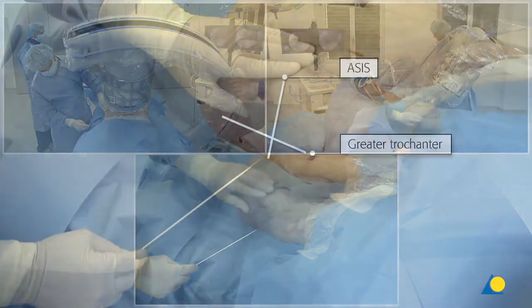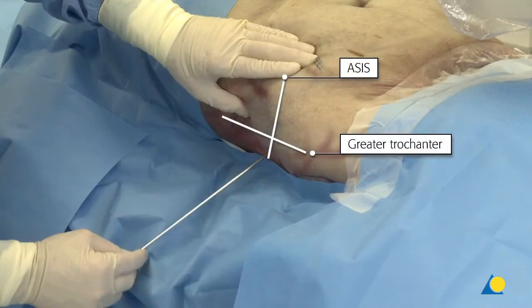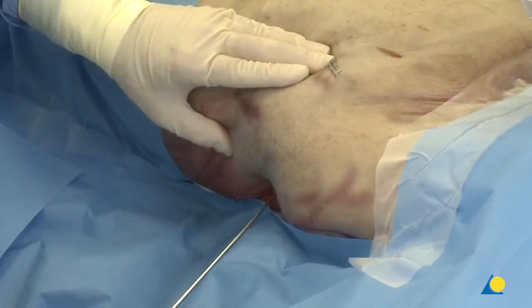A guide wire with a smooth or threaded tip is used. The preference is up to the surgeon. At the intersection of a line from the greater trochanter proximally and a line dropped from the anterior superior spine, the skin is perforated and the guide wire inserted down to the bone.